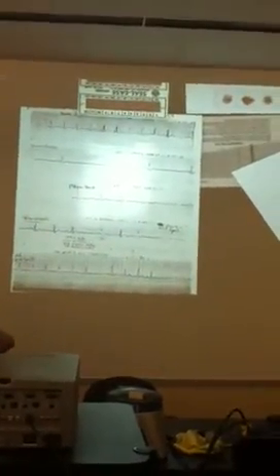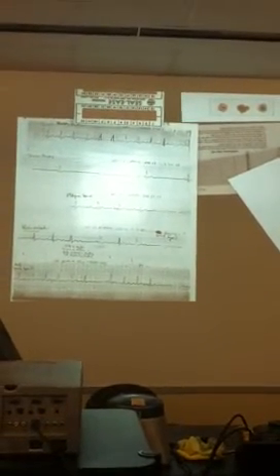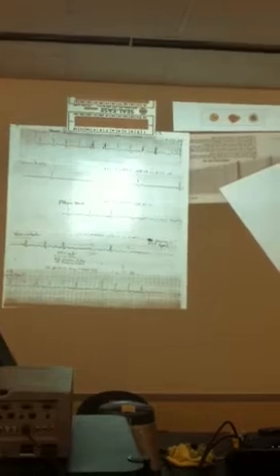And then it asks what a lead is. A lead is where electrodes are placed at various places on the body, and then they detect the electrical activity.